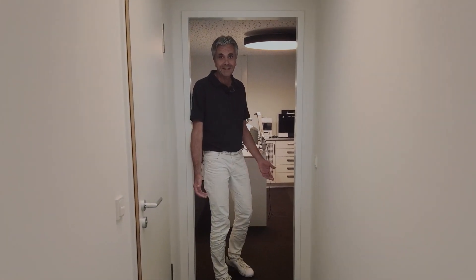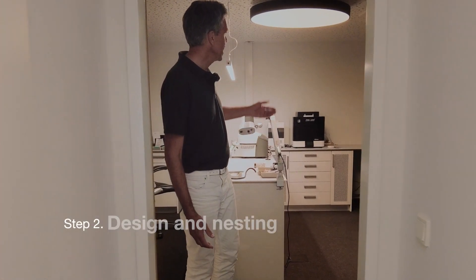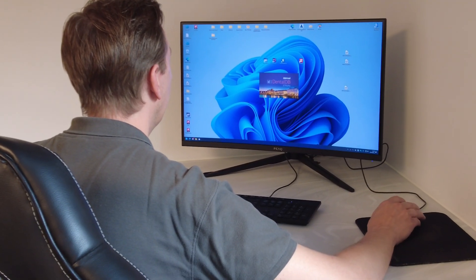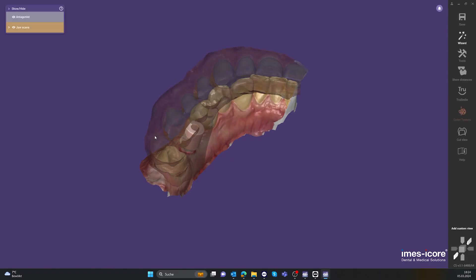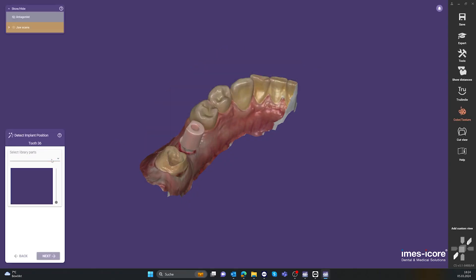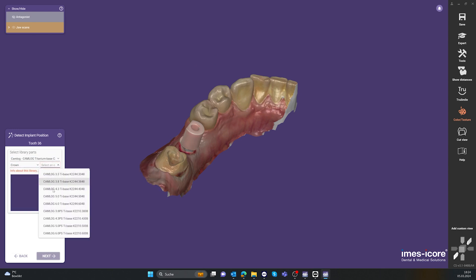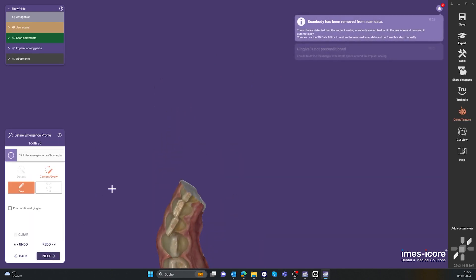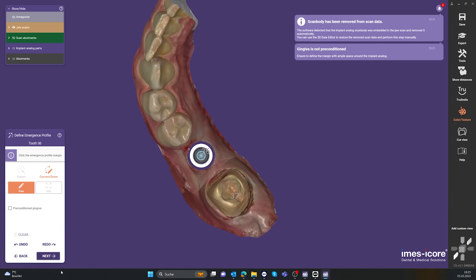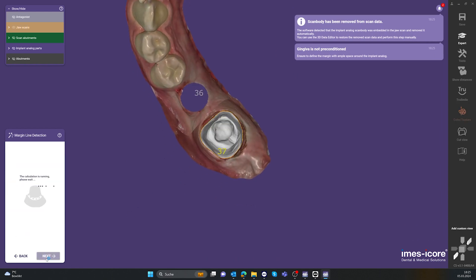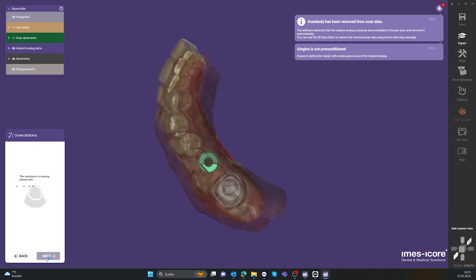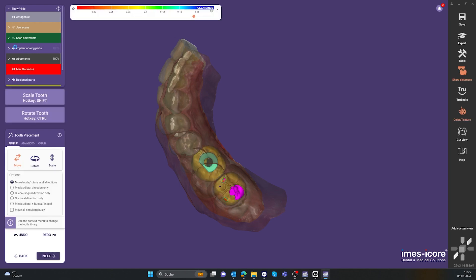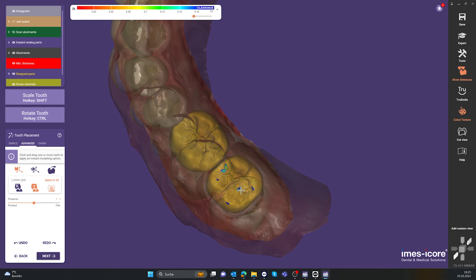Welcome to our design area. The data has already been imported and we are now in the design process. CAD-CAM processing is used to design and nest the components. We start ExoCAD ChairSide and create a new project. The design begins with selecting the appropriate implant library, determining the implant position and defining the emergence profile. The suggested insertion direction is adopted and the teeth are placed or corrected as needed. The surface of the design can be customized.